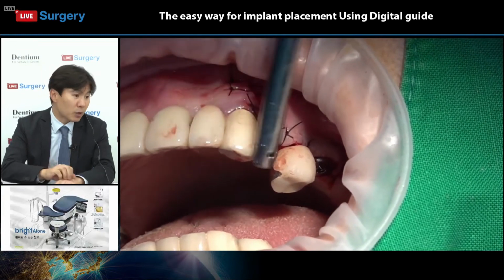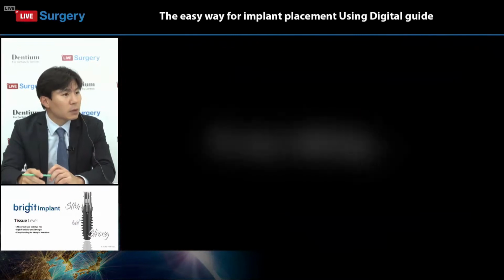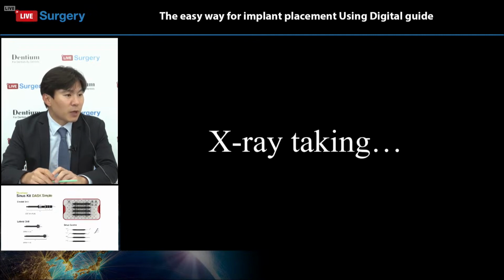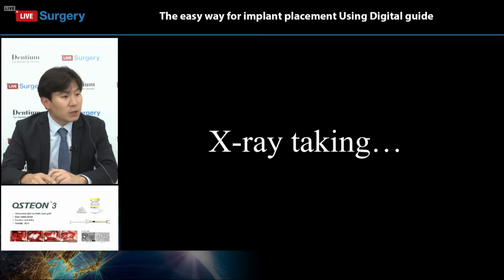He checked the stability of the implant using a ratchet. Yes, he wants to check the implant position from the X-ray, and we will have a small break before starting the surgery on the 46 area.